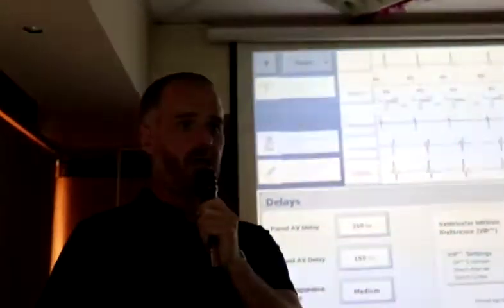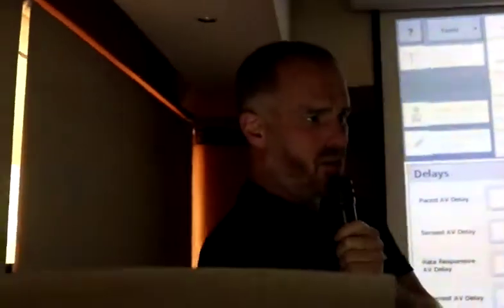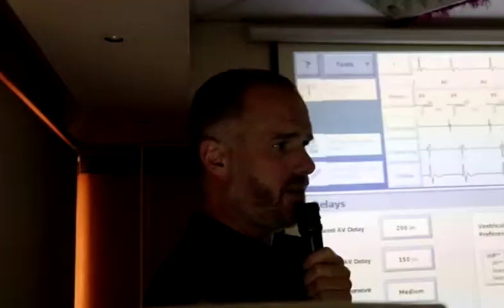Okay, so we've kind of done most of that screen. Next one we'll go to our AV delays. Remember she has intermittent AV block. So maybe 10% of the time or less, 2% of the time, maybe even 1% of the time, this lady goes into AV block and falls over.